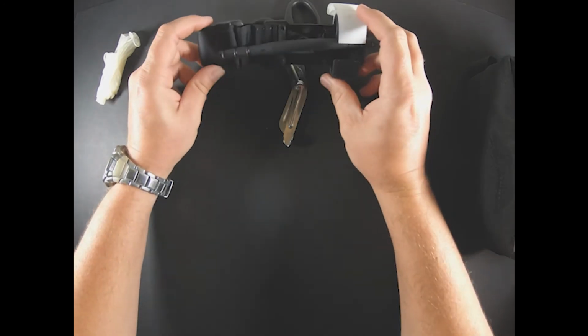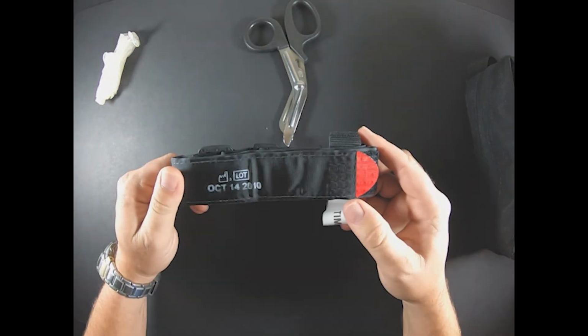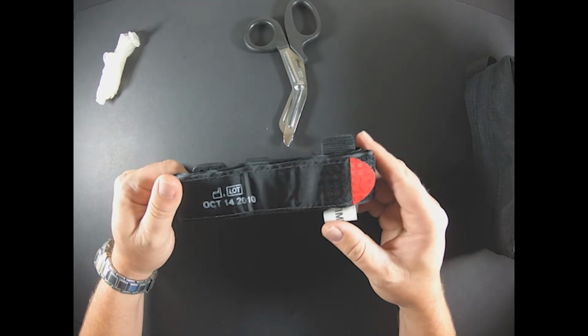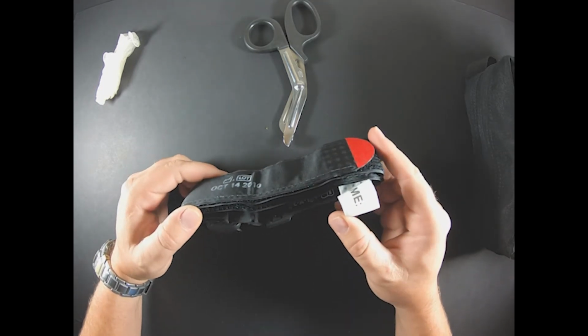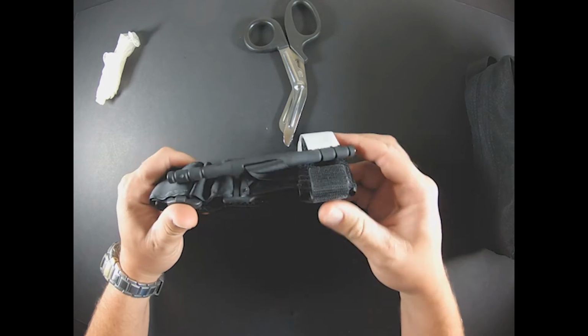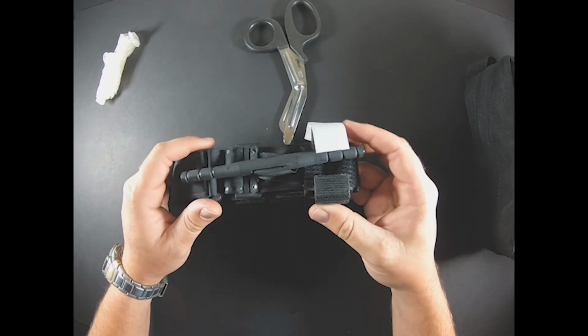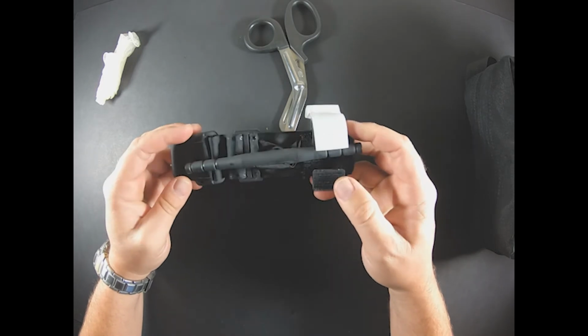All right, first thing, cat tourniquet. Very important piece of equipment for a first aid kit. I leave it open. There's a little bit of Velcro on here and it helps stick to the bottom of the seat. There's plenty of videos out there that show how these work.